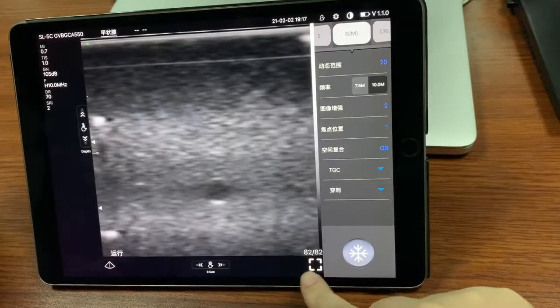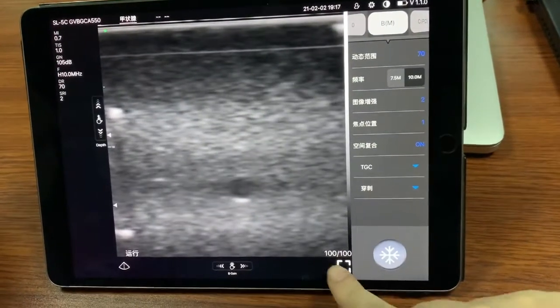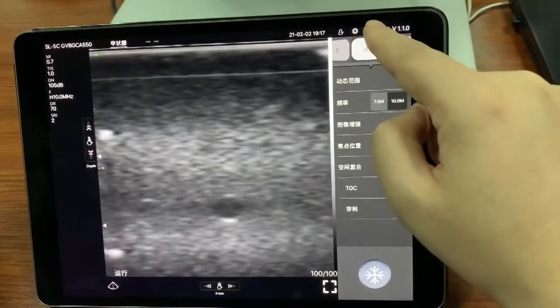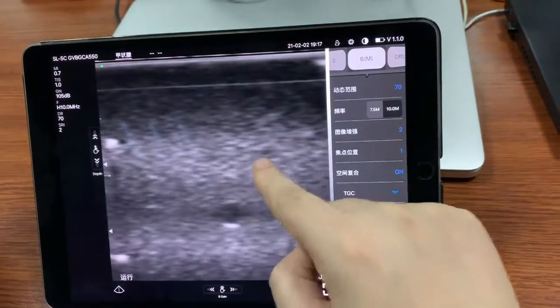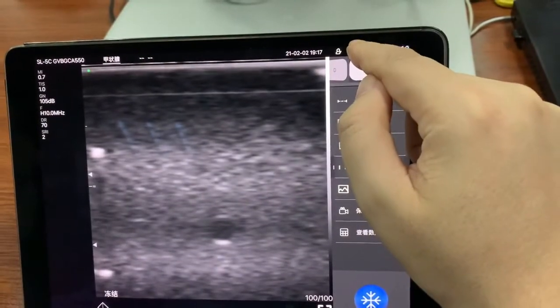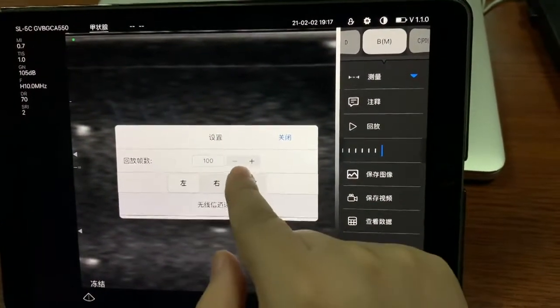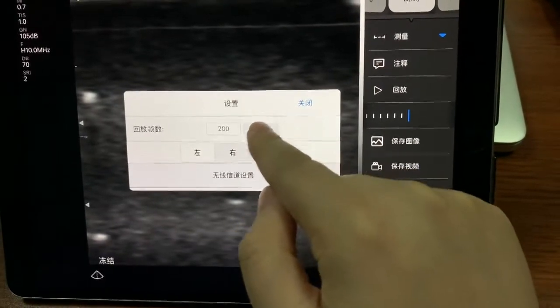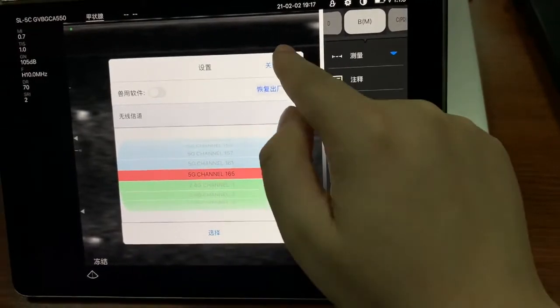Here we can enter full screen mode. We can also adjust the brightness and do some settings — the size loop from one hundred to one thousand — and configure the wireless channel of the probe.